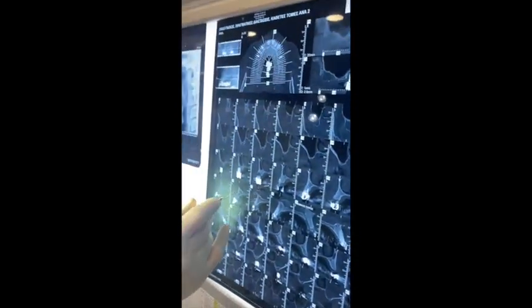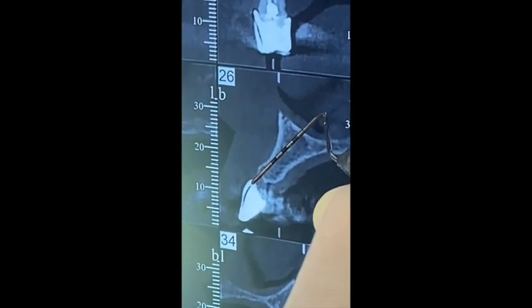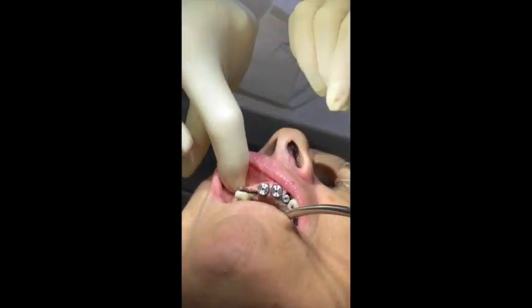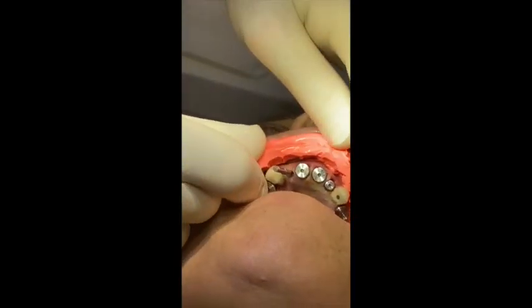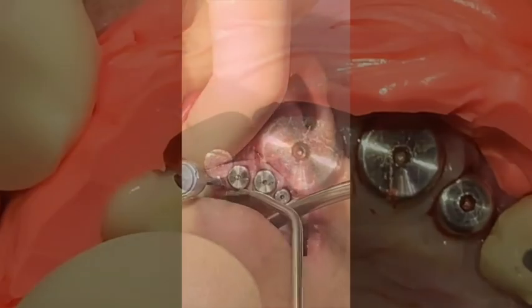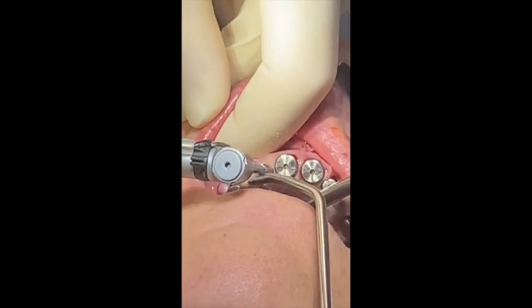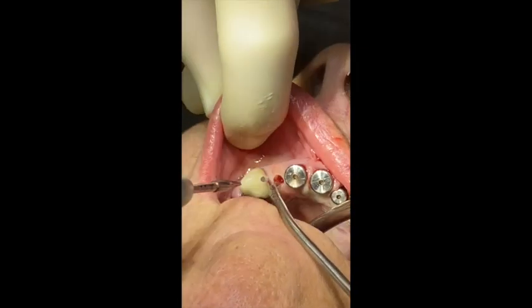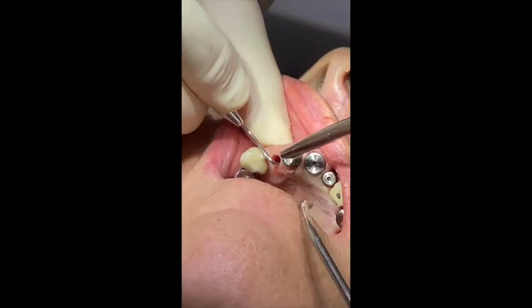26, 27 — it's about here. So here: 8, 10, 12, 8, 10, 12, 14. I can easily put a 13. I have about 10. So we'll put a 13.